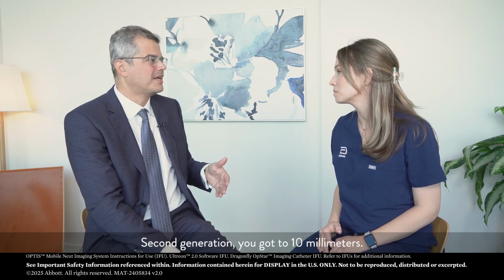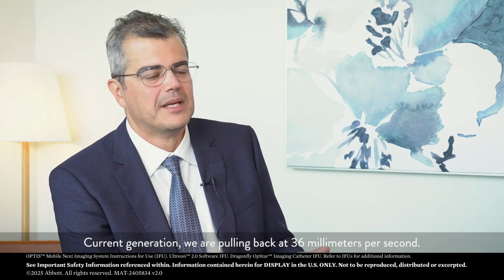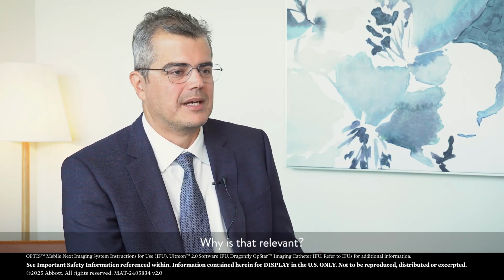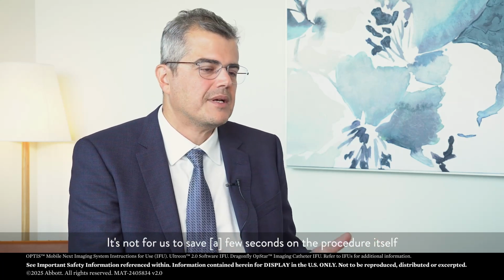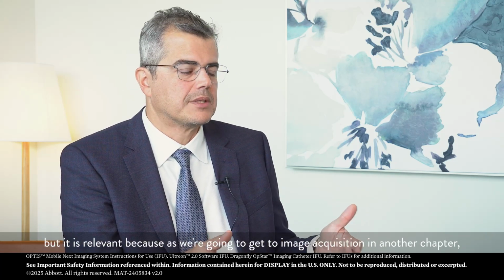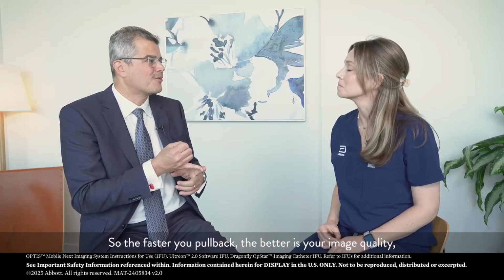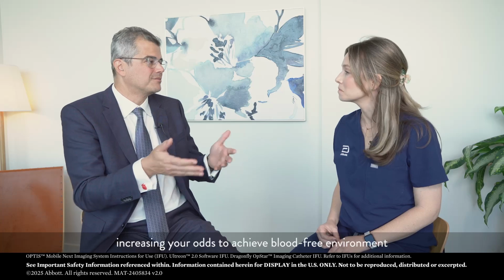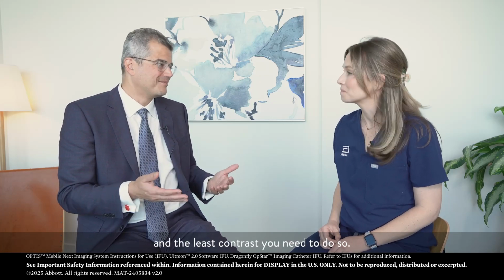Second generation, you got to 10 millimeters. Current generation, we are pulling back at 36 millimeters per second. Why is that relevant? It's not for us to save a few seconds on the procedure itself, but it's relevant because, as we're going to get to in image acquisition in another chapter, we need a blood-free environment. So the faster you pull back, the better your imaging quality, the higher your odds to achieve a blood-free environment, and the less contrast you need to do so.